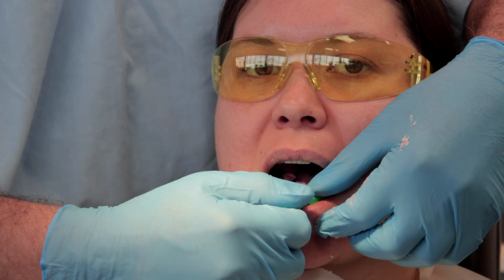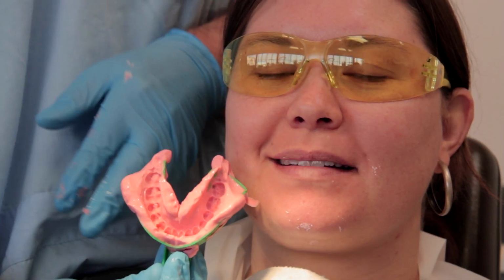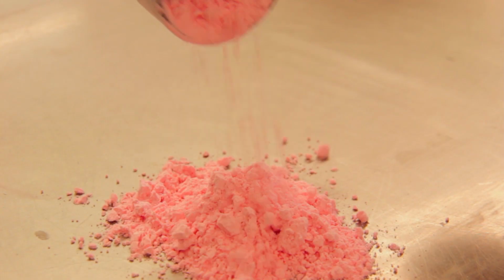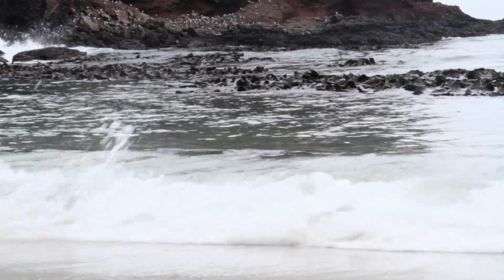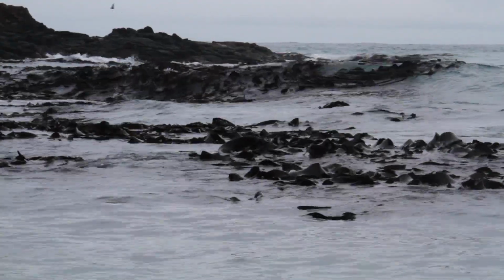Dentists take a lot of impressions of people's teeth so that they can produce models, and these models are then used to make orthodontic appliances or braces that children might wear as part of orthodontic treatment. The first step is to make an impression of your teeth like this, using a material called alginate. Dental alginate is pink and it smells like toothpaste. But in its original form it was brown because it's made from seaweed that grows on New Zealand's coast.